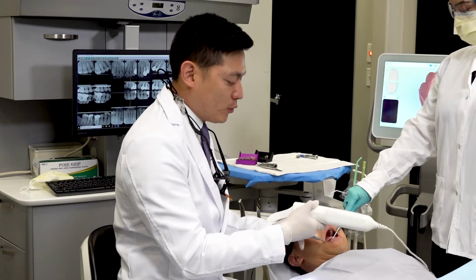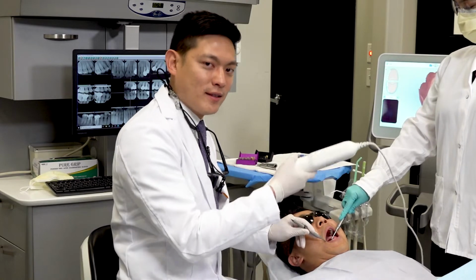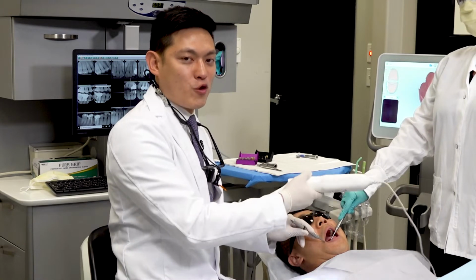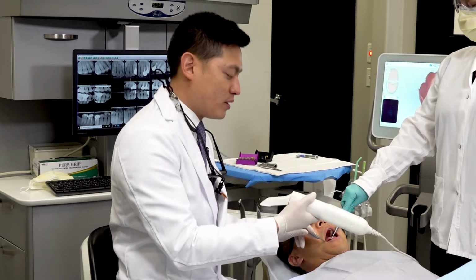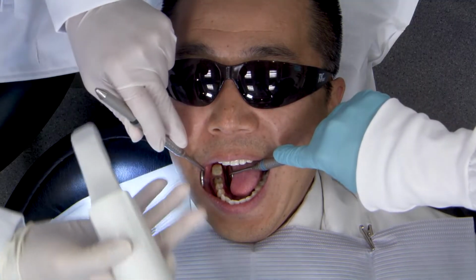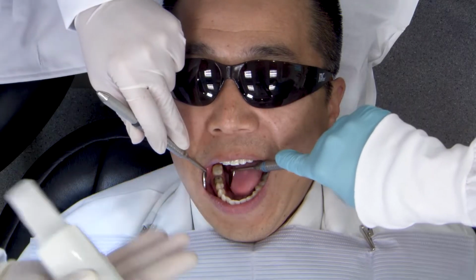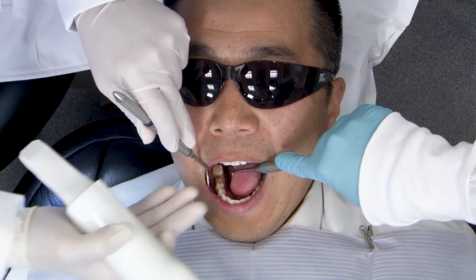Now, one of the key ways to avoid any distortions or noise or misalignments goes back to the fundamentals of keeping things dry. The more dry the field is, the more accurate the scanner and the software within the system can create an accurate digital model. So I'm going to capture the quadrant scan on the lower right area. So the key, starting out with the fundamentals, making sure that things are dry, things are isolated.